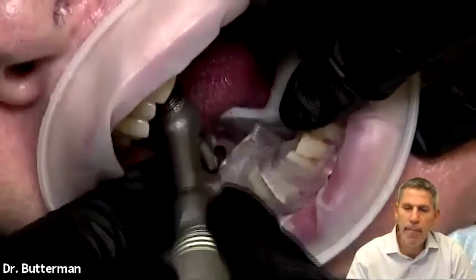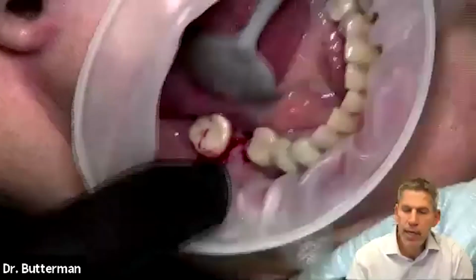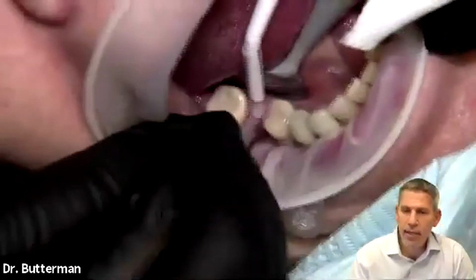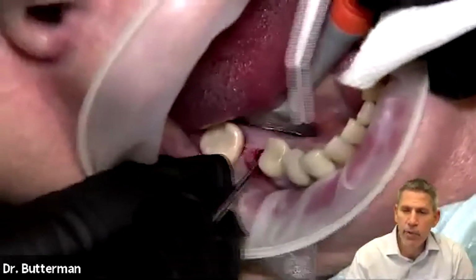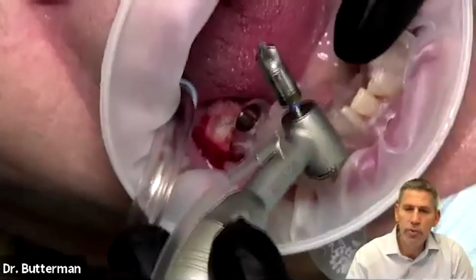Our patient is numbed up. My first step: we've got more than 3 millimeters of remaining keratinized tissue, so I typically will do a punch in that situation. If I don't have enough keratinized tissue, then I would do a flap. But in this case, we're going to have plenty of keratinized tissue, so we do our punch through the guide.